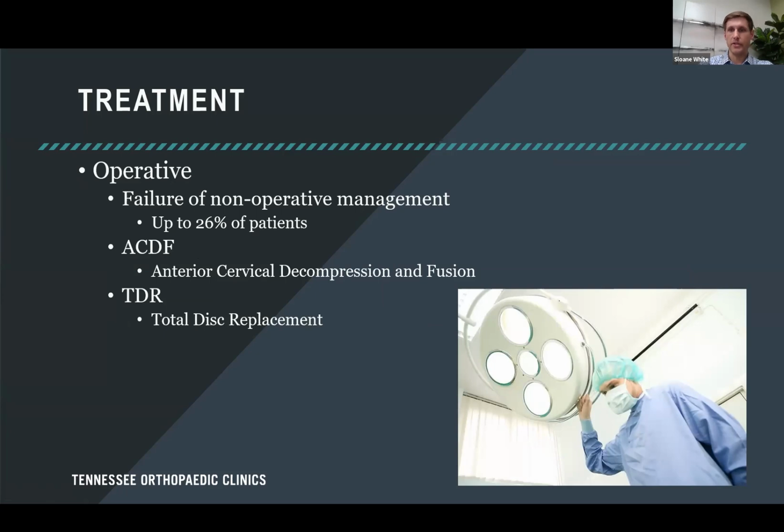It's been around for many years. And for issues of disc herniations and pinching of nerves, even in the spinal cord, this is the gold standard treatment. Something that's been relatively new, I'd say relatively new, at least the past 10 years, is something called a total disc replacement. Let's talk about these two options.